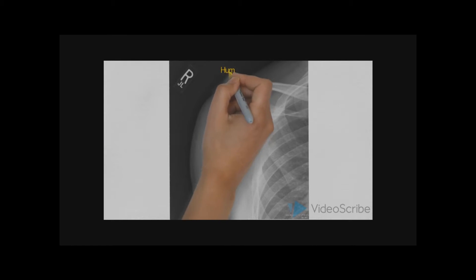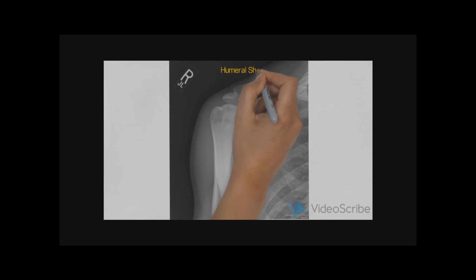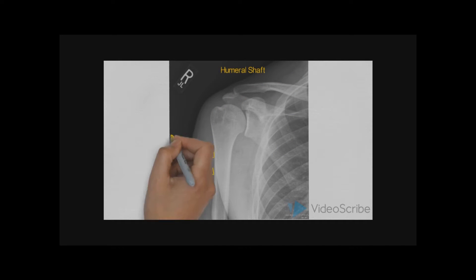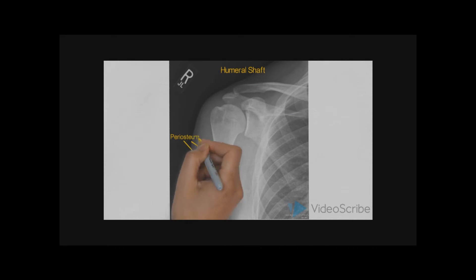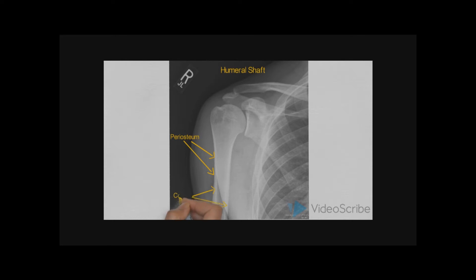When assessing the humeral shaft, we need to ensure that the soft tissue surrounding the diaphysis or shaft is continuous and has no pathological features. Then we assess the shaft for periosteal reactions. We ensure that the periosteum is continuous around the entire border of the humerus.